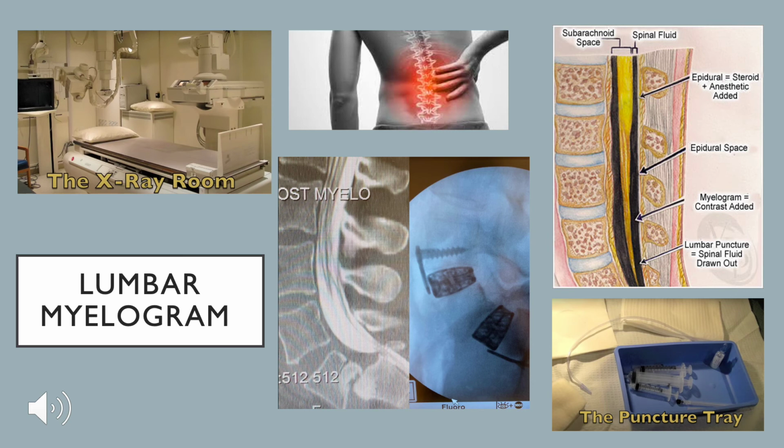During the procedure, patients are fully conscious, therefore, holding still is crucial in determining the injection site. Finally, the grand purpose behind a lumbar myelogram is for doctors needing additional information, even after MRI and CT testing.